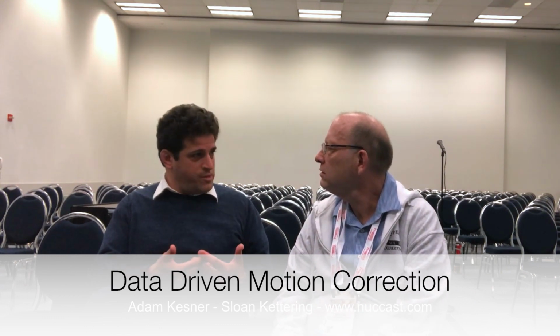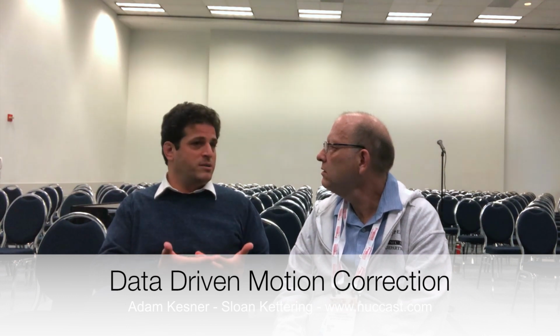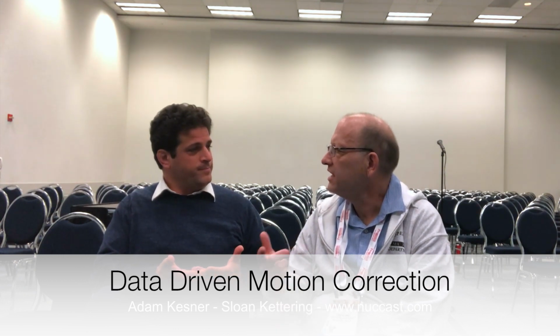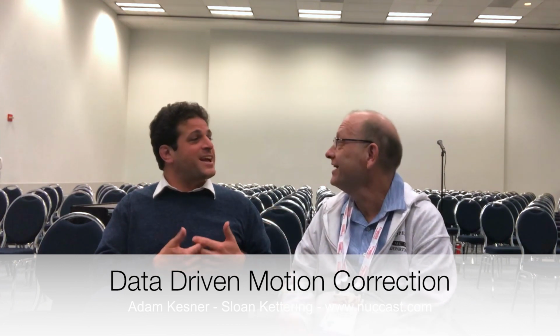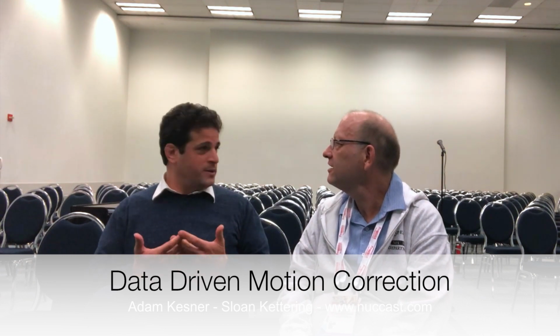We can do a lot with it. But motion, I think, is a very simple embodiment of an ability to do more with our data. And as our PET scanners get better, we've got more data in a short amount of time, so we've got more information that you can use. That's exactly right. These data-driven methods only get better as PET hardware gets better.